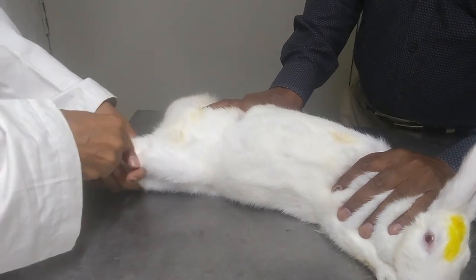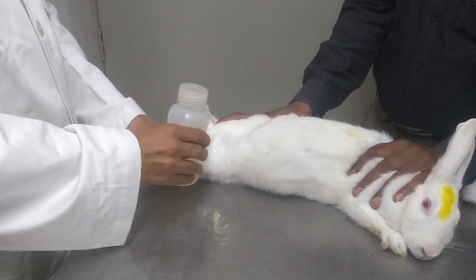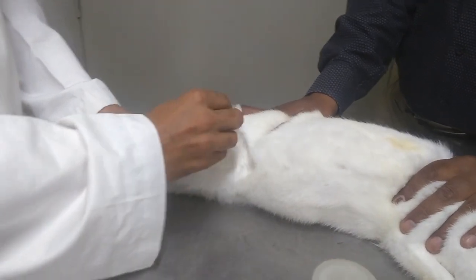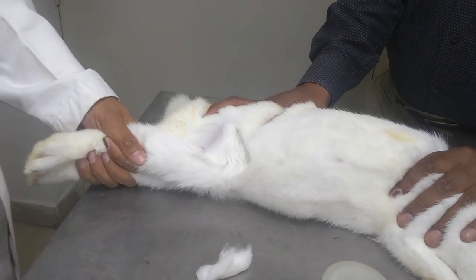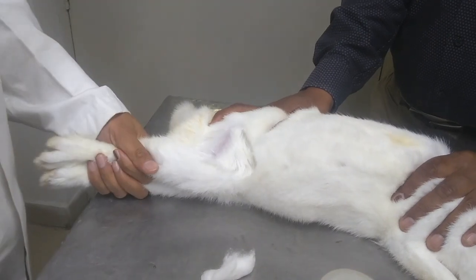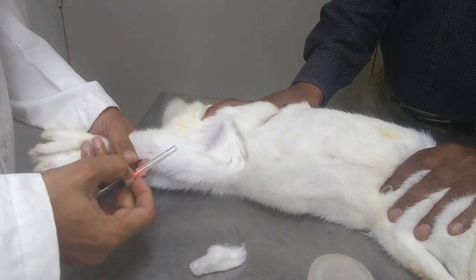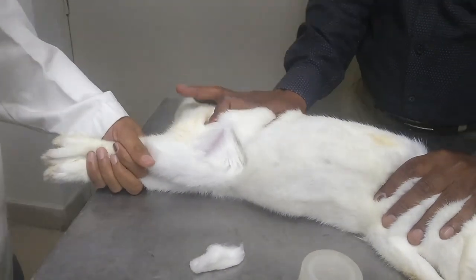We have to catch hold of both the legs, and we have to sterilize the area using alcohol. We have to look at the thigh muscles. The skin should be cleanly visible. There are two kinds of injection that we give: one is intradermal and another one is subcutaneous. Today we'll be doing a subcutaneous injection.